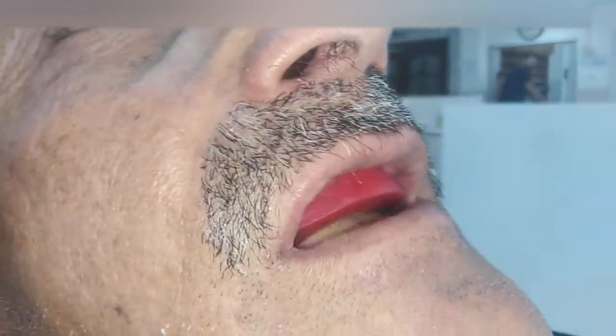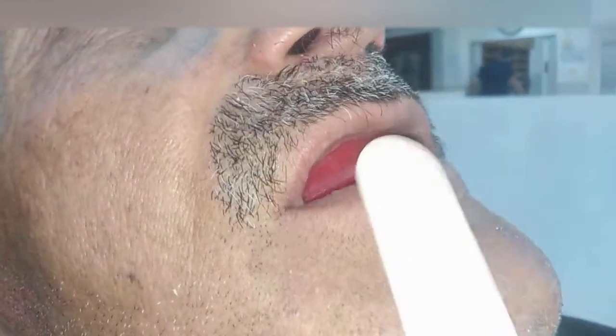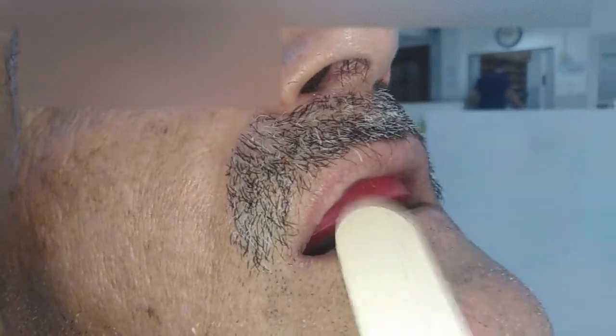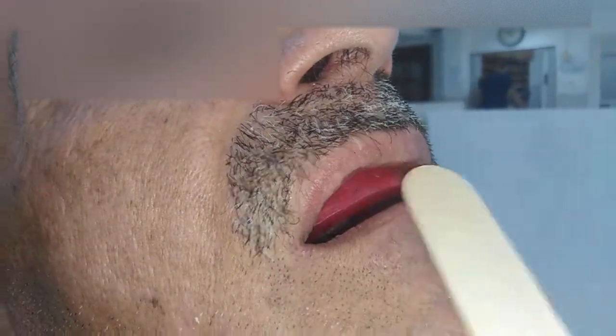Notice that while the patient is not speaking, the lip is touching the wax rim. But see the difference when he begins speaking — look, the active lip is coming up. The active lip had gone up and there is an empty space in between.